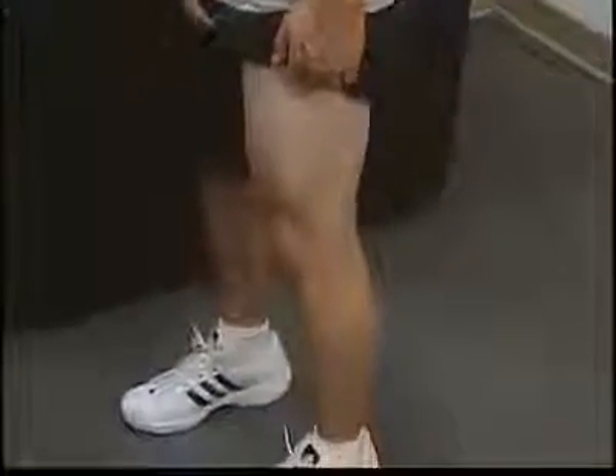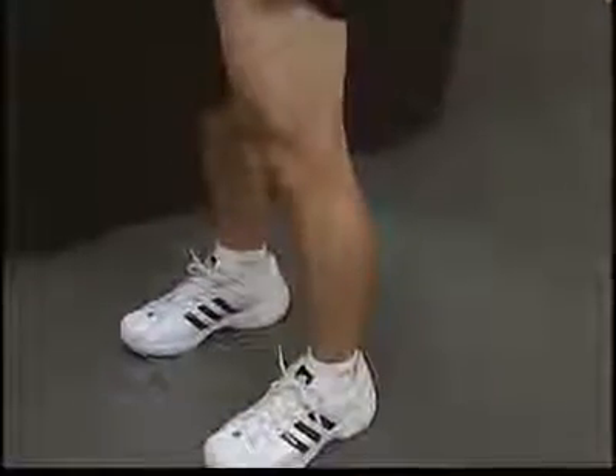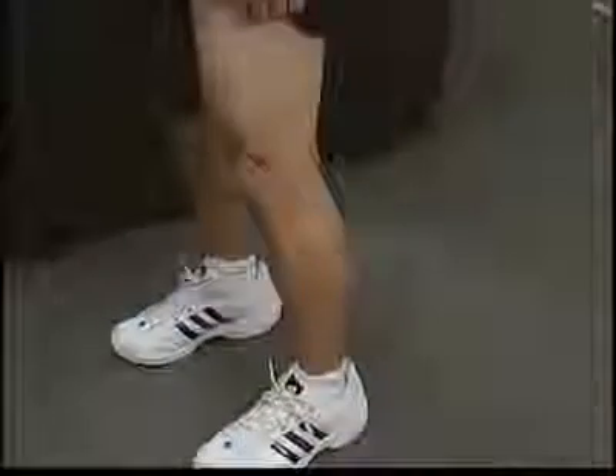Have the patient stand with their feet shoulder width apart, weight evenly distributed, and both knees slightly flexed.